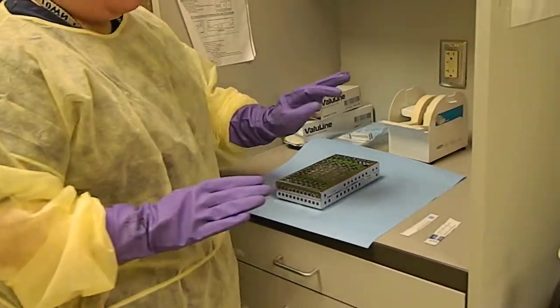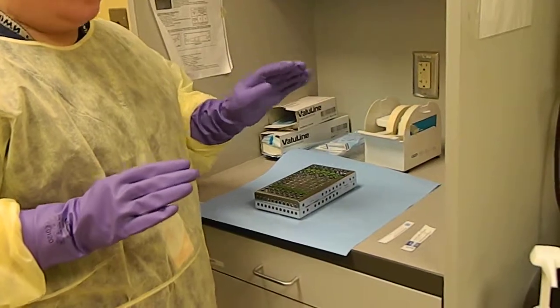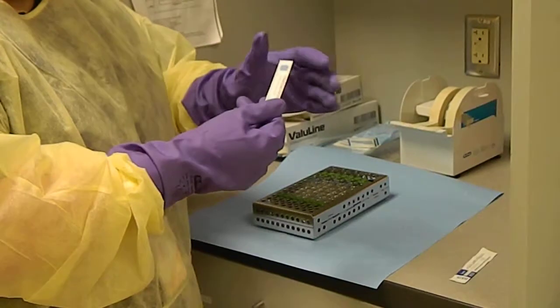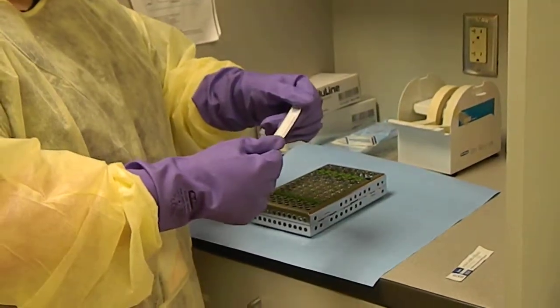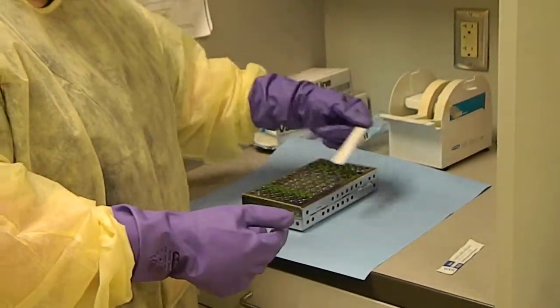Now there's a couple different indicator strips that we use for sterilization, for heat sterilization. One is the indicator strip which is a paper strip and we're going to put that inside of the cassette. And before we do we're going to put our initials and the date and slide that in.